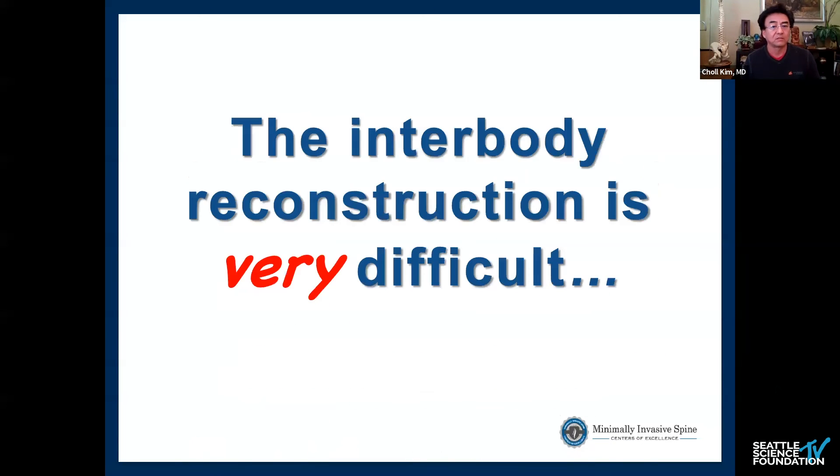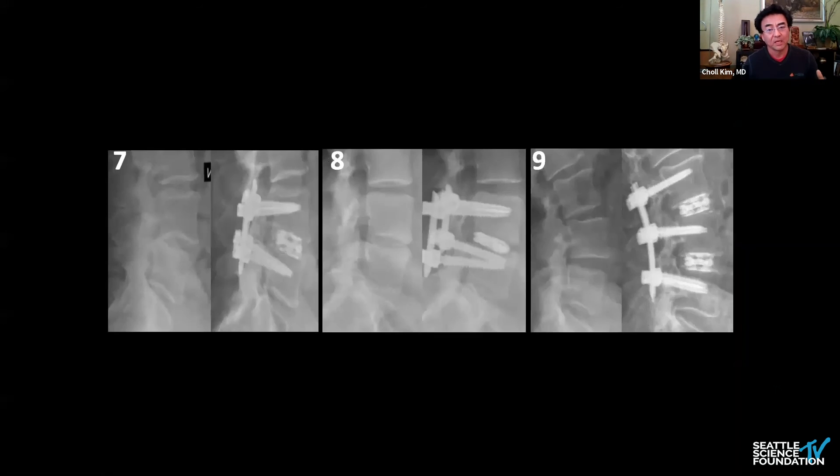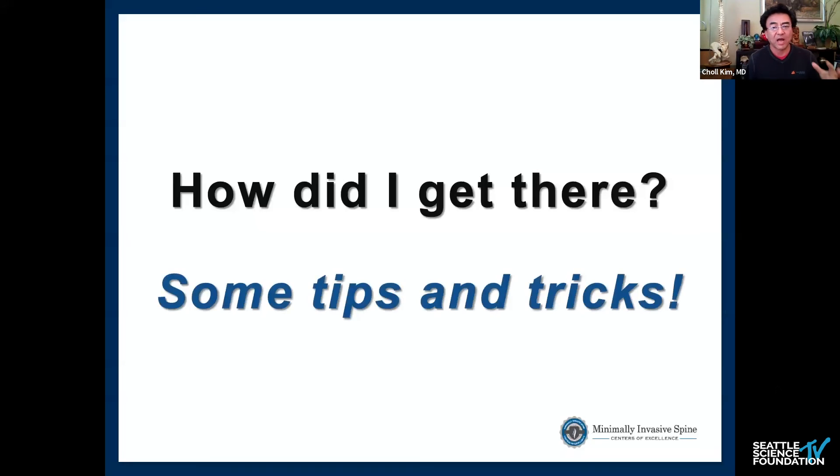Another major learning was that interbody reconstruction is very difficult. I rely heavily on indirect decompression and noticed a fair amount of subsidence early on. Looking at the first three, middle three, and last three cases side by side on pre- and post-op X-rays, the early cases show pretty ugly results, the middle cases are improving, and the last group — cases 13, 14, and 15 — shows very good interbody reconstruction with minimal subsidence.